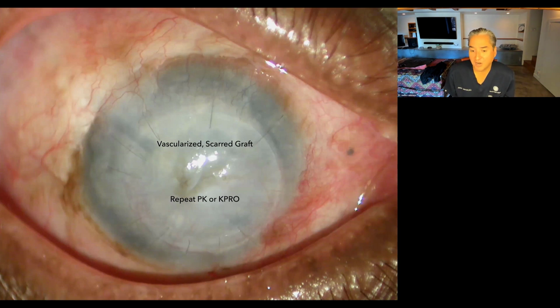When you're doing a sutured IOL, it can be difficult. Yamane can be difficult, and you can have bleeding, you can have vitreous prolapse, all these things that make it a little bit trickier when you're trying to do the endothelial keratoplasty. Plus, I think it's a little more traumatic on the graft to put that in an eye with all the inflammation from the Yamane or sutured IOL. So I have moved to doing two-stage procedures in which I fix the lens problem first, and then I let the patient heal for about a month or a month and a half, and then I'll go do a DSEC in those scenarios.